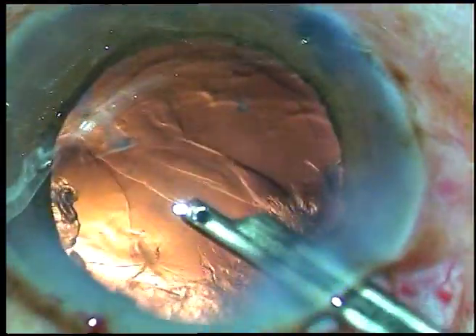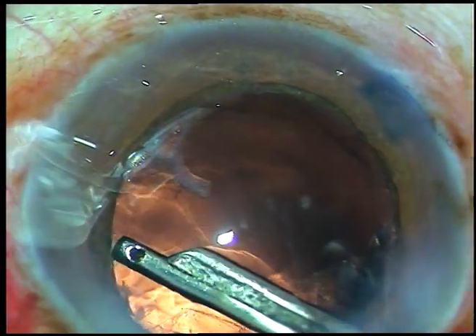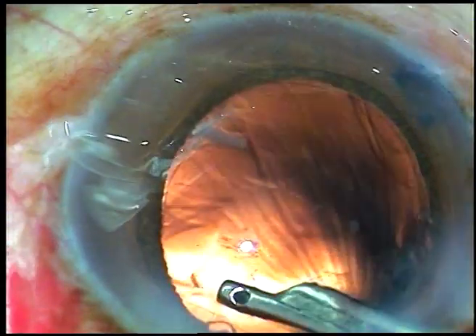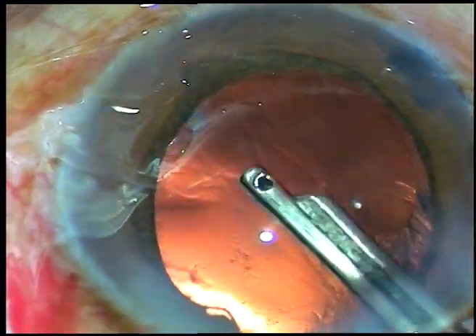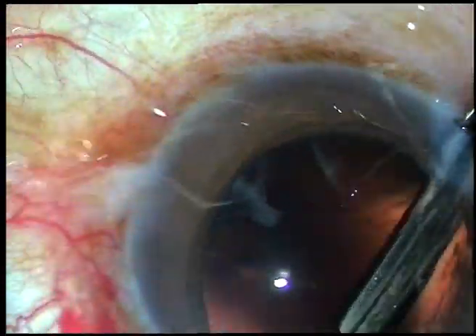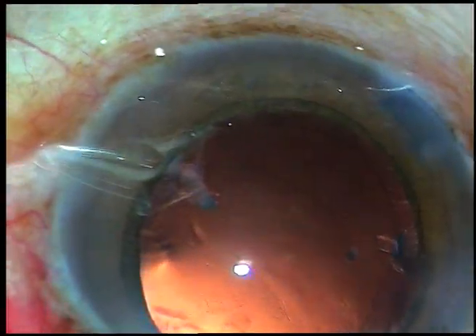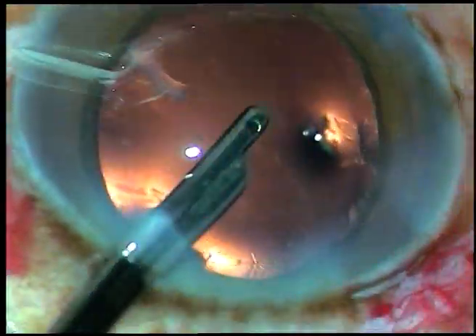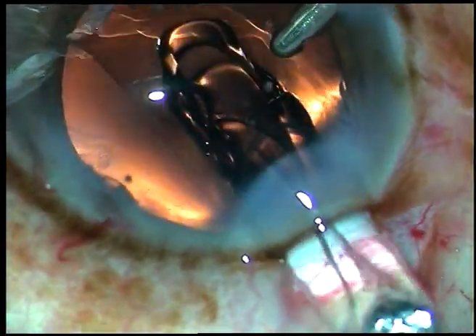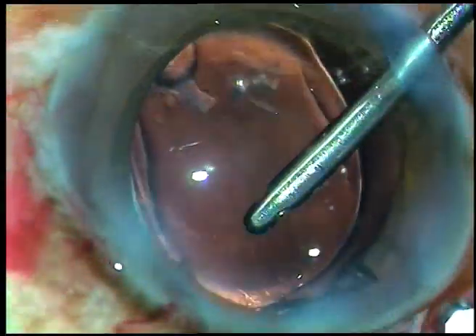Viscoelastic substance is injected. A Simcoe cannula is used to remove the cortex. Only a little cortex remains because most of the cortical matter was incorporated into the nucleus. I am going through the right sideport to remove the cortex from the sub-incisional area. Now I am using the right sideport to keep the anterior chamber formed, and under irrigation I am implanting the intraocular lens.